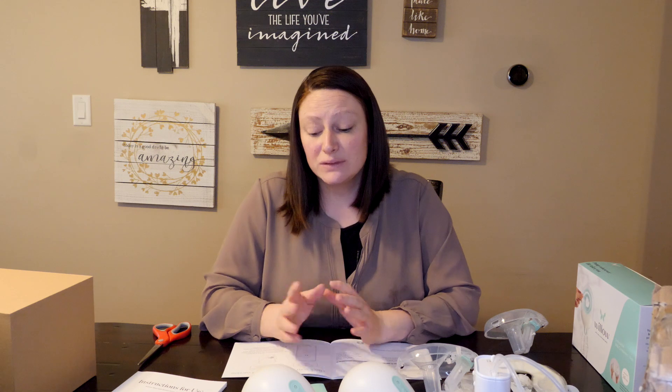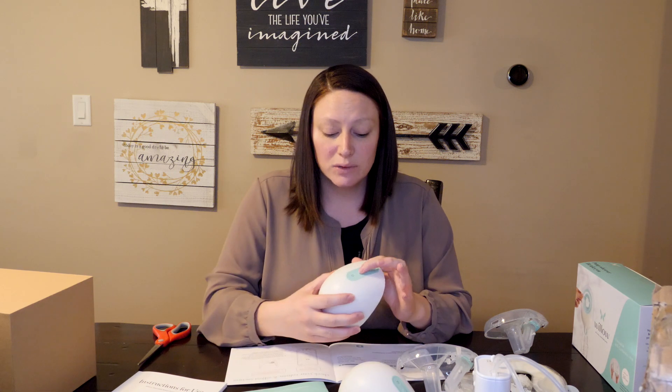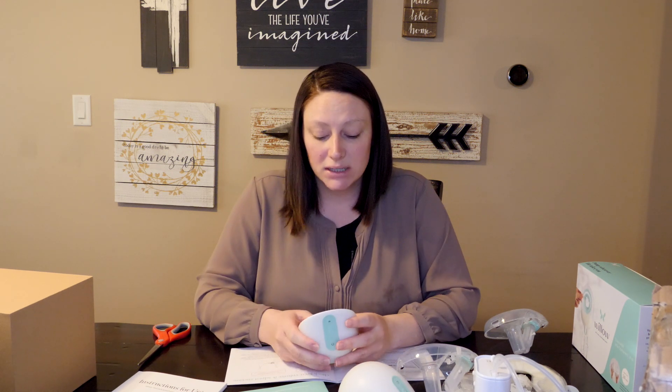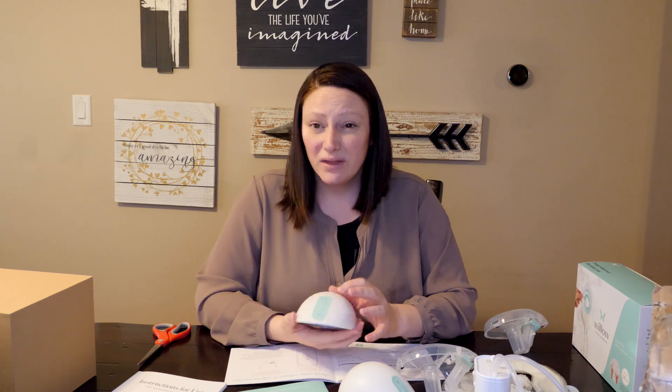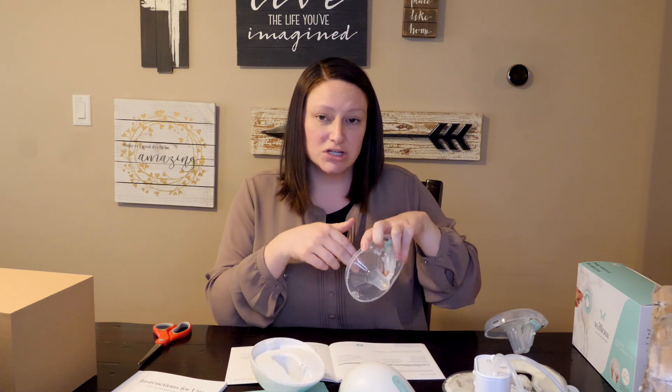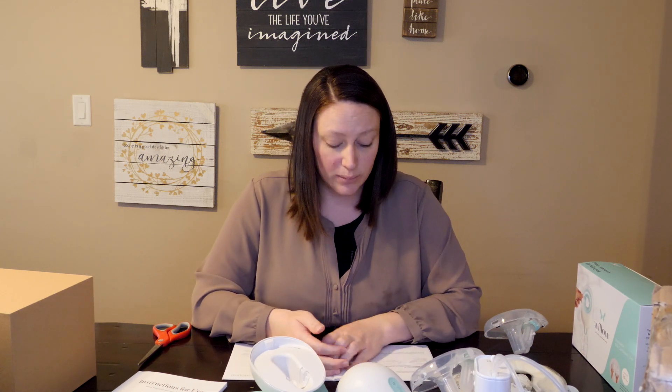The app was really easy to use and it was easy to pair the pumps. It was easy to adjust the suction with these little buttons. It did take a little bit of practice — you have to really press it up against your breast when it's starting to latch, because there is a suction that holds the pump on your breast. It's kind of like your baby: they suction on there, and then to break the suction you have to place your fingers between the flange and your breast, very similar to whenever you break the suction when your baby is eating.